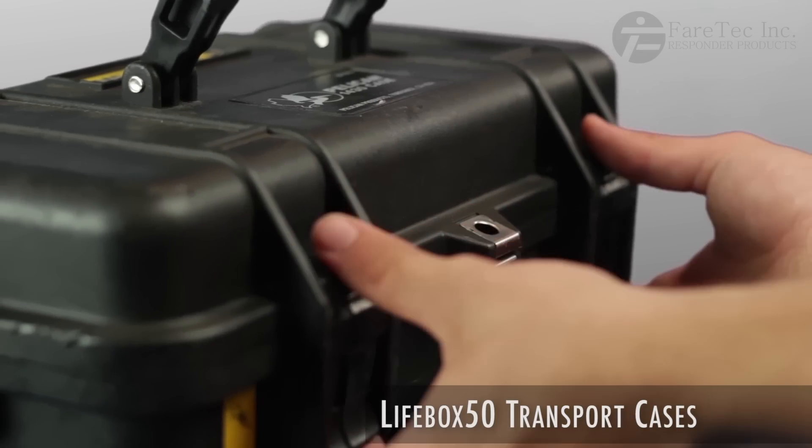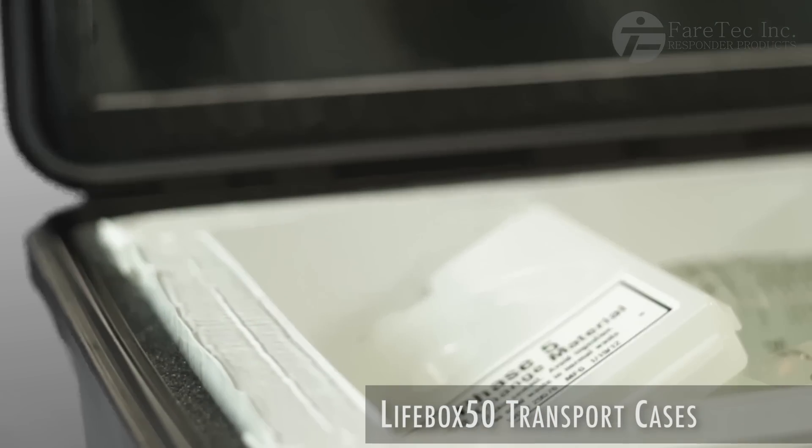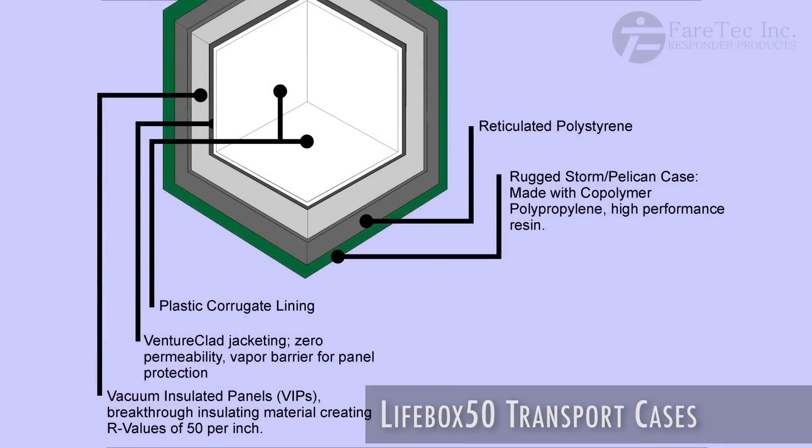The Lifebox 50's interior is built using state-of-the-art thermal insulation panels. These are encased by a rugged watertight hard plastic exterior. Their unique chemical composition provides thermal performance unequalled by conventional insulation materials.